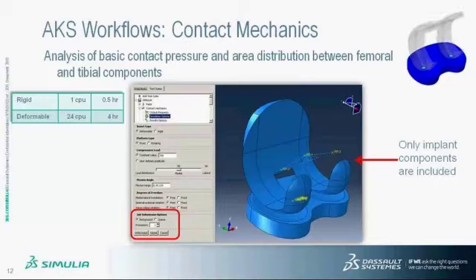Once the user is satisfied with their simulation options and output requests, they can then write the input file and submit the simulation. The simulation can run either in the background or be submitted to an HPC queue using either single or multiple processors.